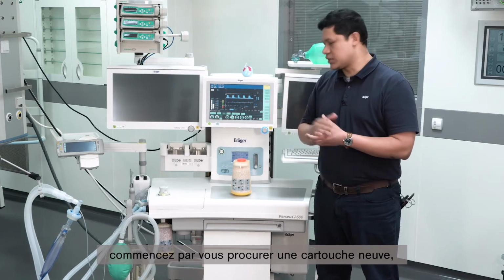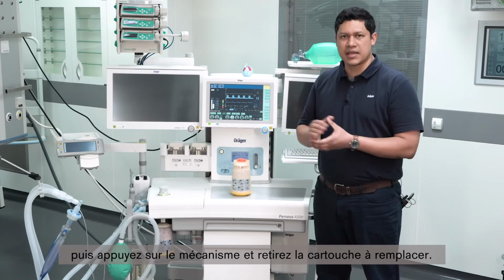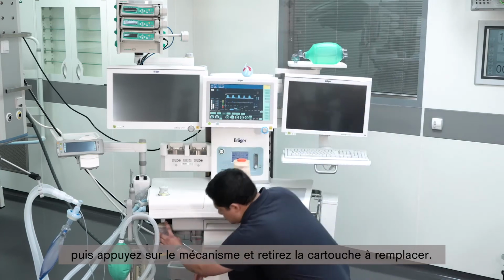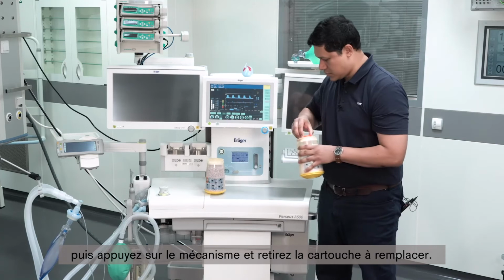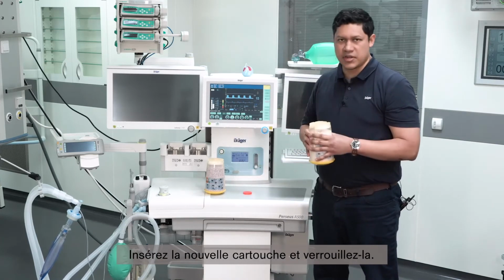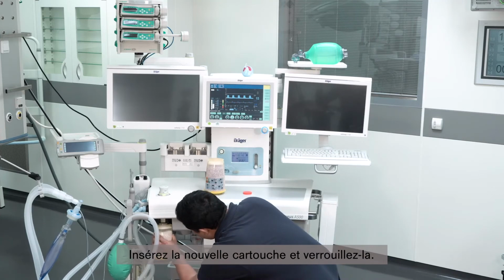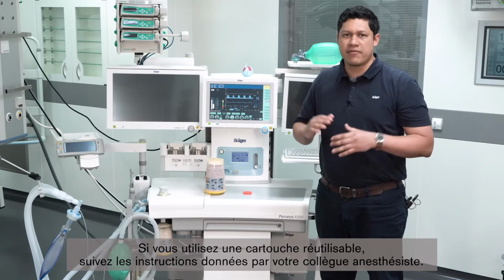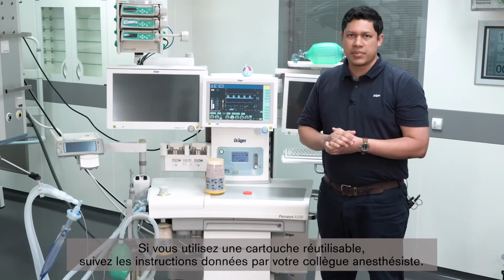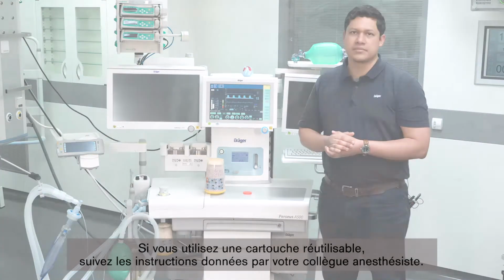The procedure to exchange the soda lime canister when you have the click system in place is to get a new cartridge available. Then you press the release button and you slide the canister out. Slide the new canister in and lock it. In the case you have a reusable cartridge, please get instructed by an experienced anesthesia colleague.